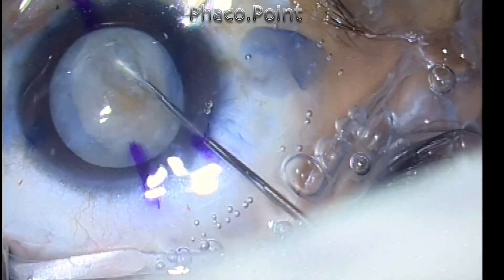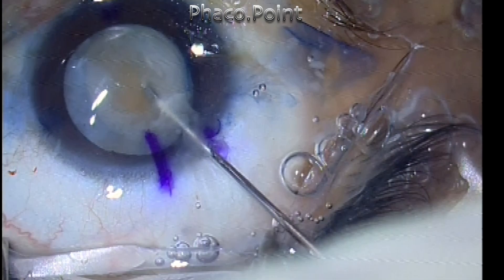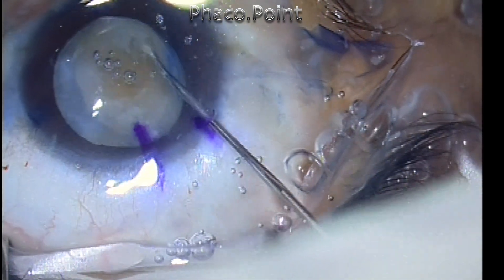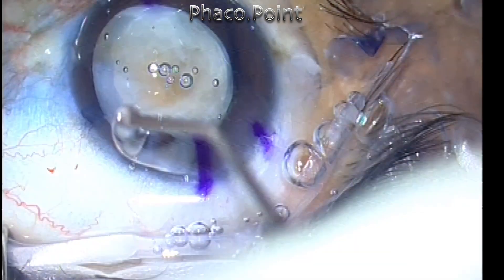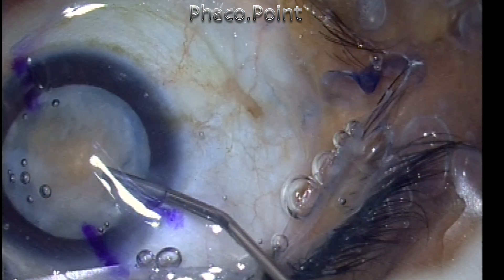The cortical cleavage hydrodissection is strictly not needed. The reason why I'm using the hydrodissection maneuver in this patient is to gauge how hard the underlying small hard nucleus is. And as I uncap the cortical shell, I find that there is a very hard brown cataract that lies beneath the surface.